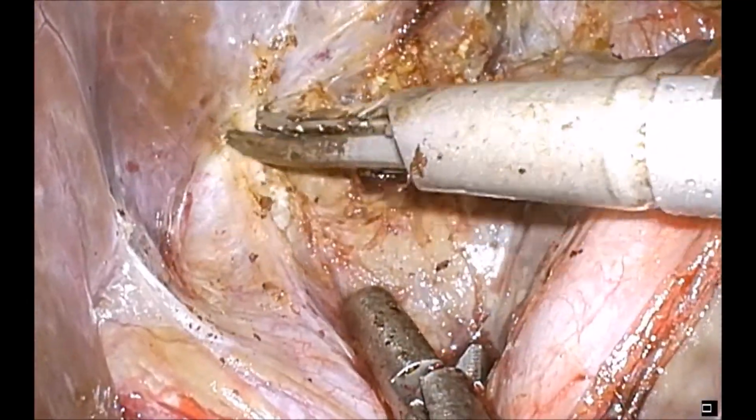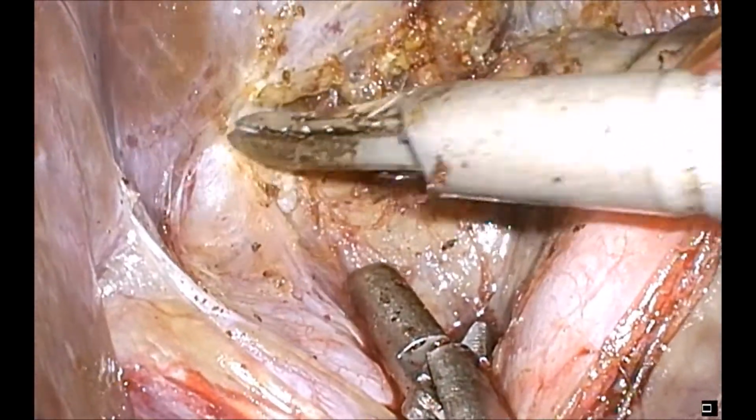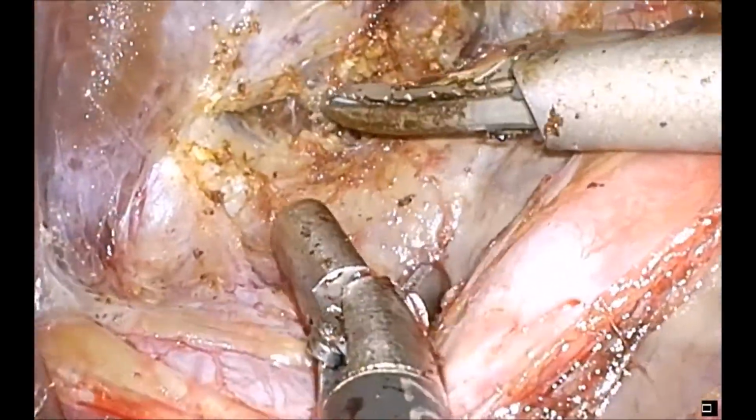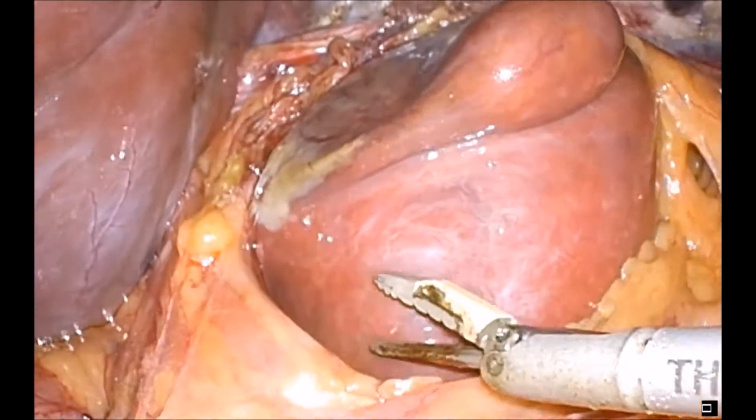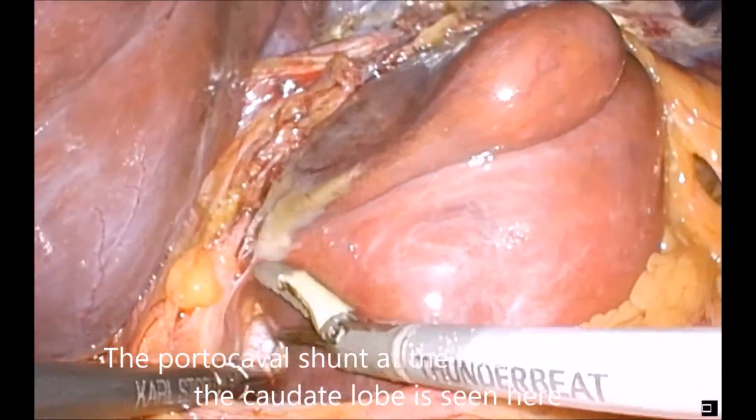The fibrous tissue between the caudate and the left lateral section is extended along as far as possible in order to achieve a good medial margin.